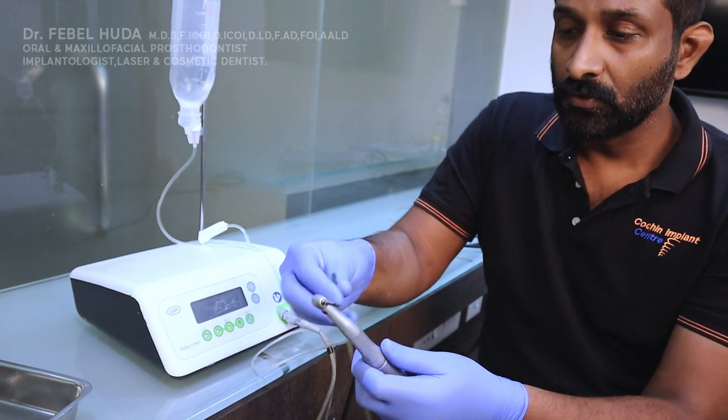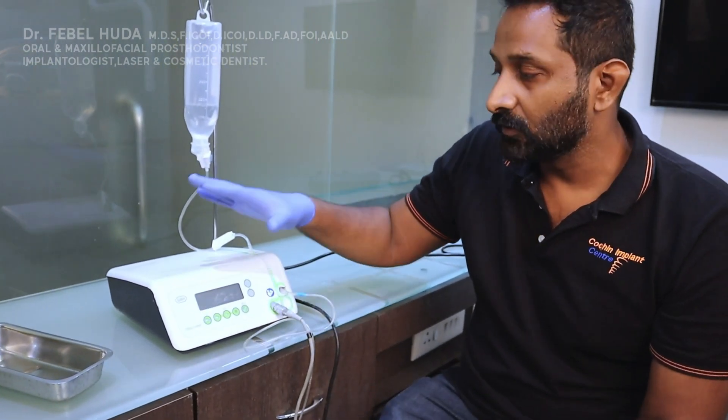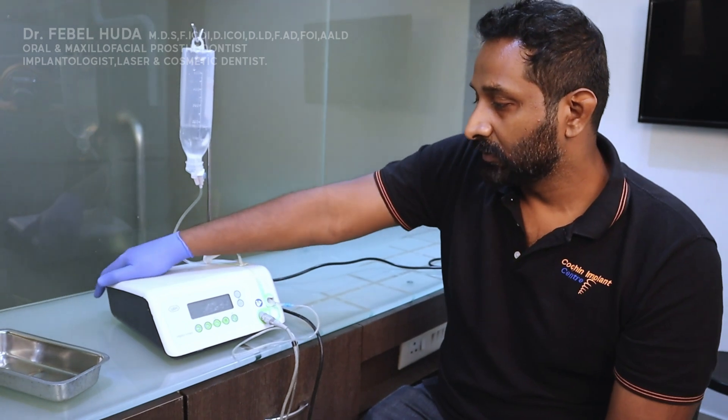The handpiece itself attaches to the motor. That covers all the attachments for your physio dispenser — once everything is in place, the unit is ready to work. Now we'll switch on the panel.